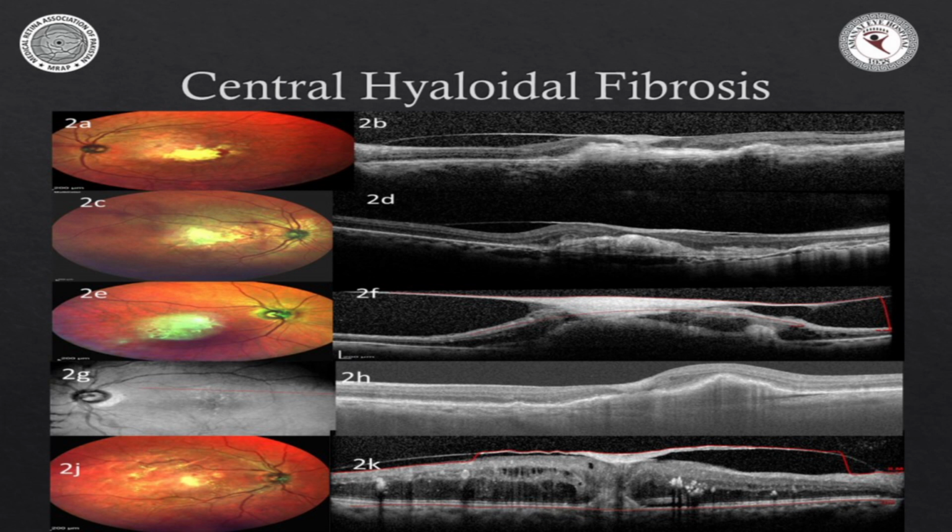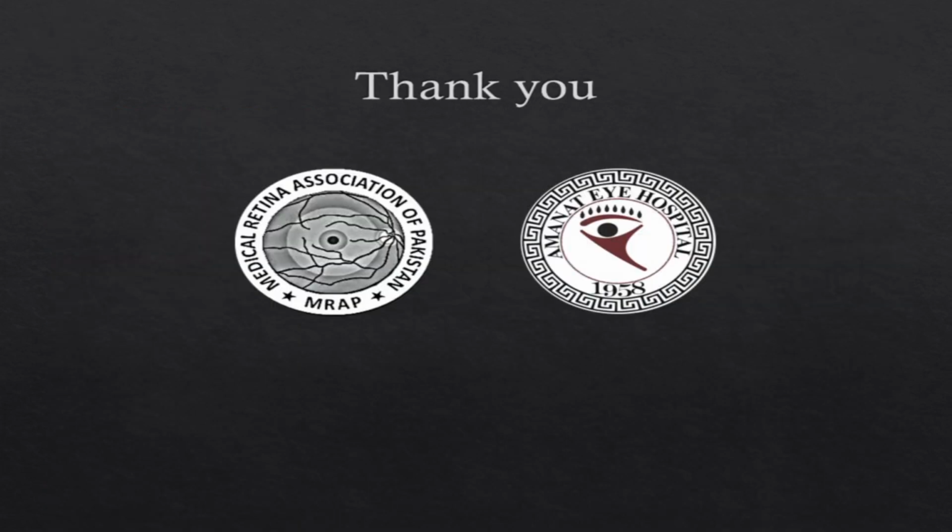These were 5 or I think 8 cases out of 6,000 consecutive OCTs that came into my clinic. What we are saying is that this is rare to see, but it may be a more advanced case of a more frequent and more common underlying pathophysiological process that we're just not yet picking up. So I thank you for your patient listening, and I'll welcome any questions.